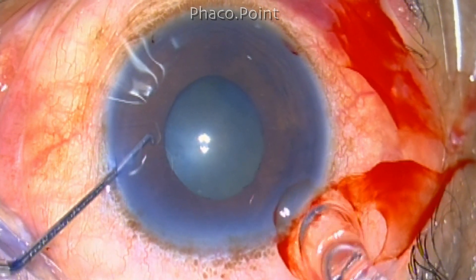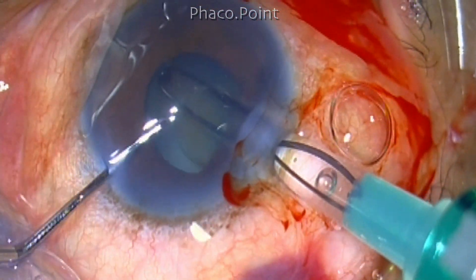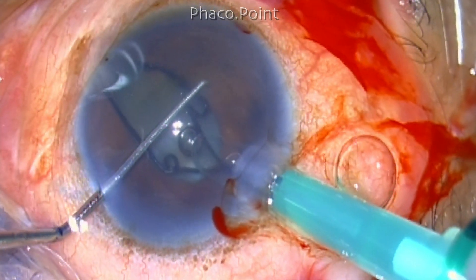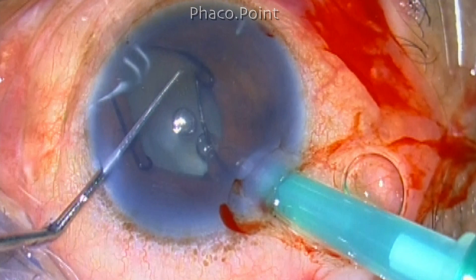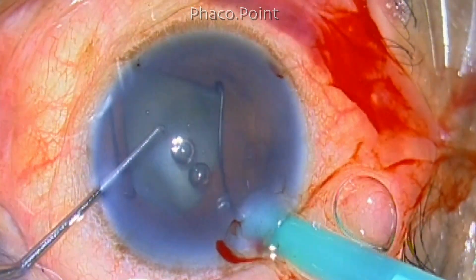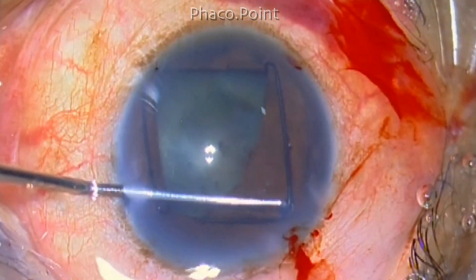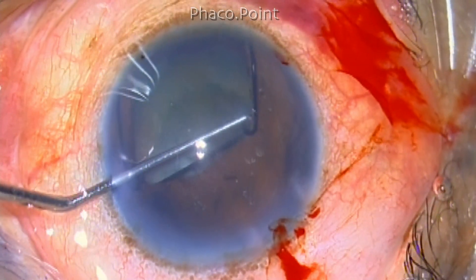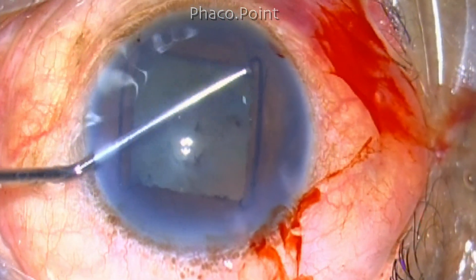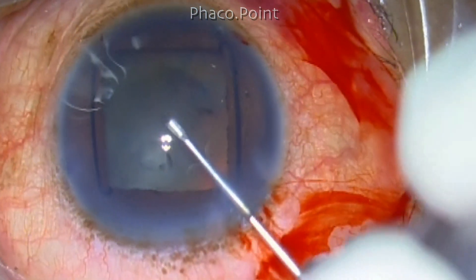Injecting the device can be done through the pre-existing 2.8 mm clear corneal incision — no extension is needed. The leading loop can be easily made to engage the pupillary margin, and if you are deft enough, you can engage three loops at once into the pupillary edge, as seen in this video. The trailing loop is then simply tucked toward the pupillary edge, engaging the pupillary margin, creating a square opening of the pupil.